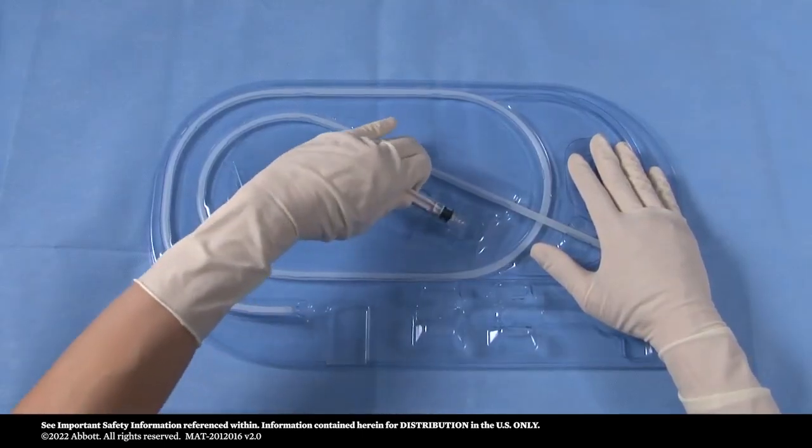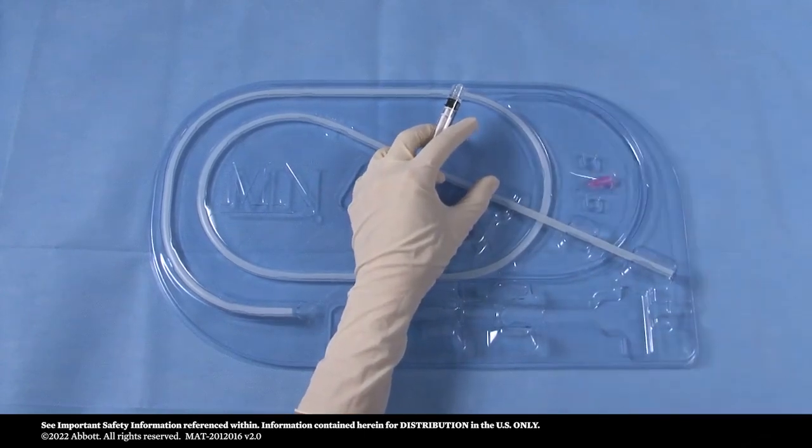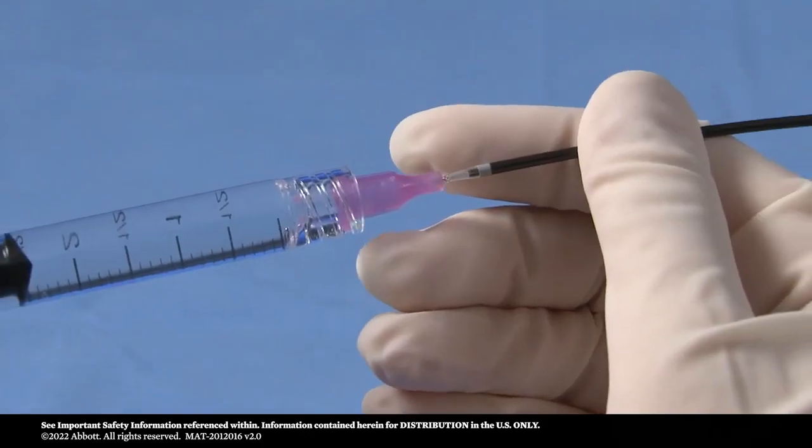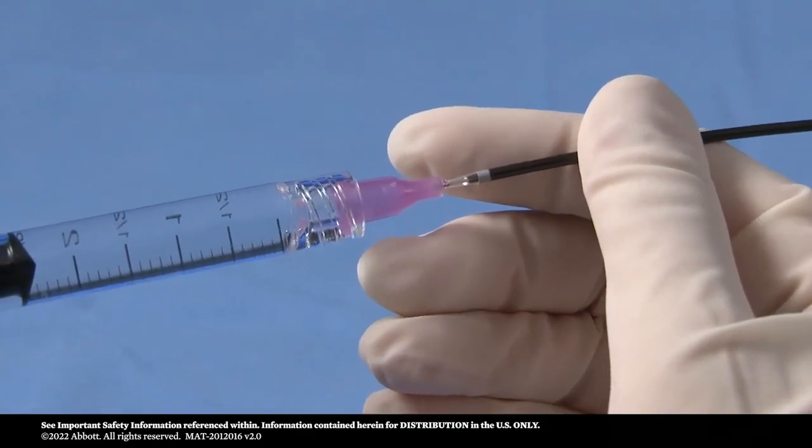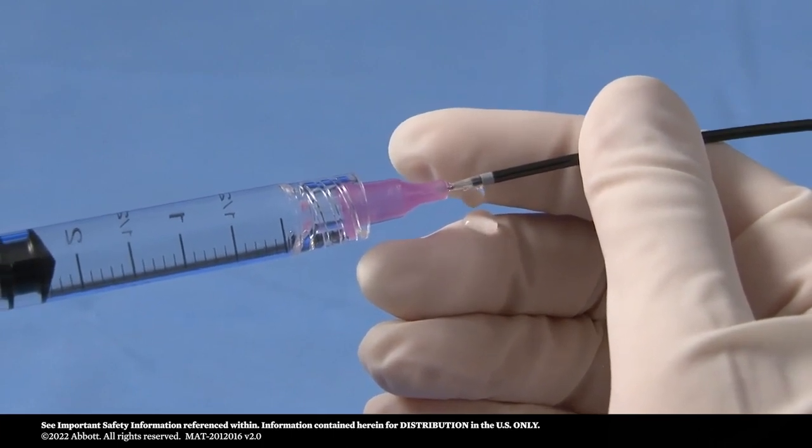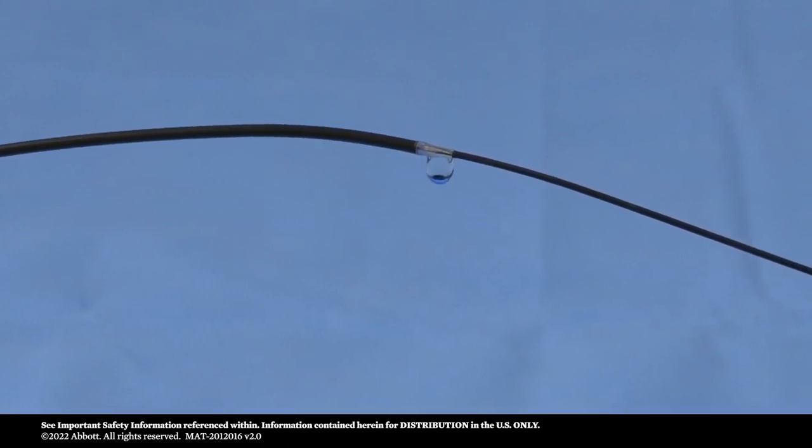Next, fill the 3 milliliter syringe with saline and attach the syringe to the flushing tip. Insert the end of the flushing tip in the distal end of the device and flush. Note that saline will exit at the catheter tip and at the guide wire exit port. This demonstrates the flushing procedure is complete.